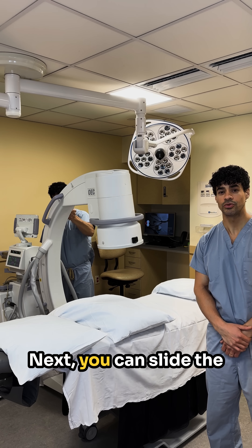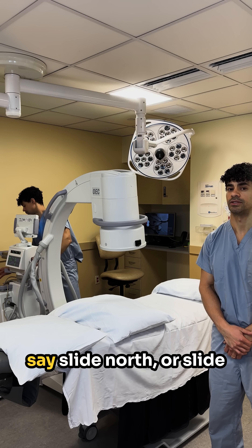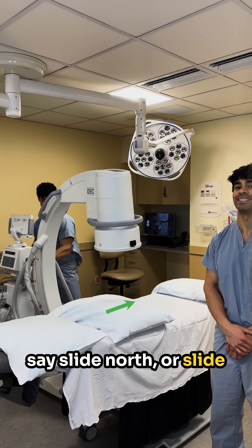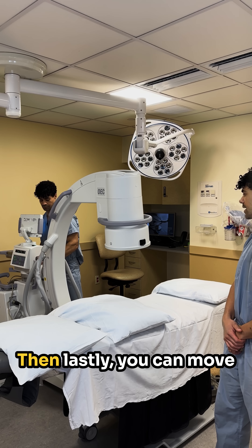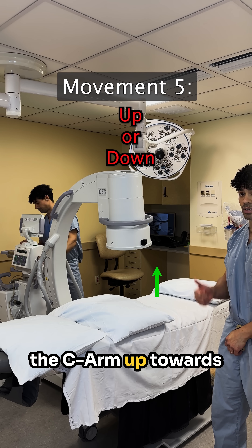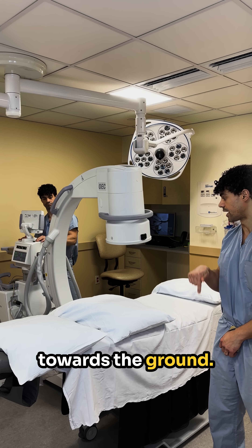Next, you can slide the CRM up towards the head — we sometimes say slide north — or slide south towards the feet. Then you can also move the CRM up towards the ceiling or down towards the ground.